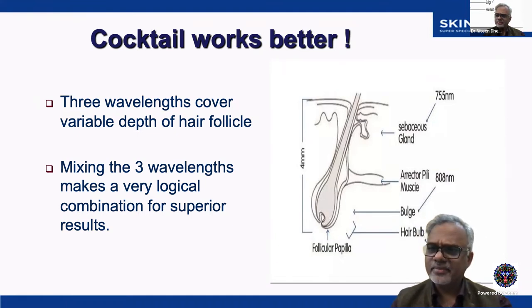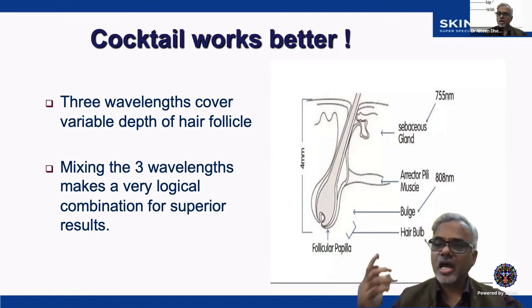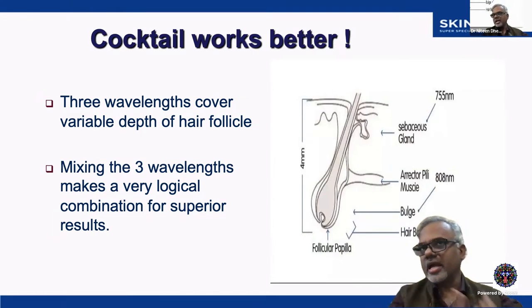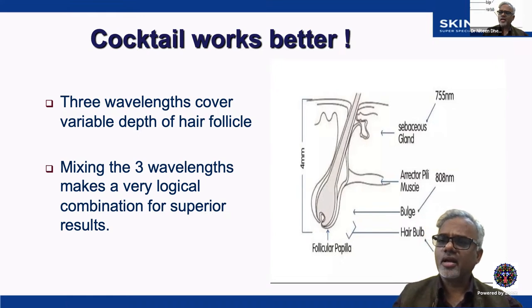Initially, we saw there was a laser medium, that laser medium gets excited and that emits the photons. But nowadays, you don't need a laser medium. The research in the diode has made very high quality diodes. Now the diodes of today can generate any wavelength. So a diode is basically an electronic circuit, and that can convert electricity into another photon. So the diodes of today can generate 800, 810, 820, 860, 900, 1064. Any color can be produced from a diode.